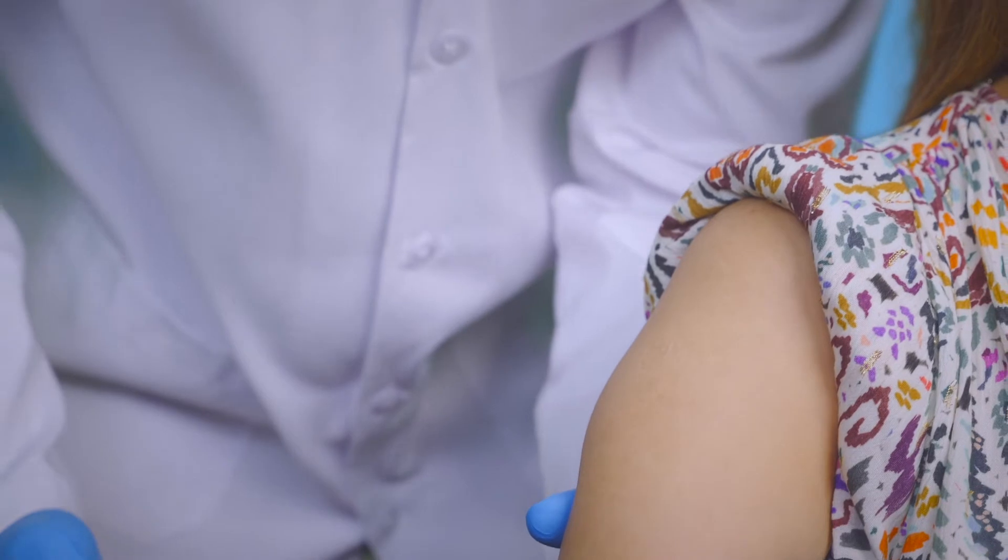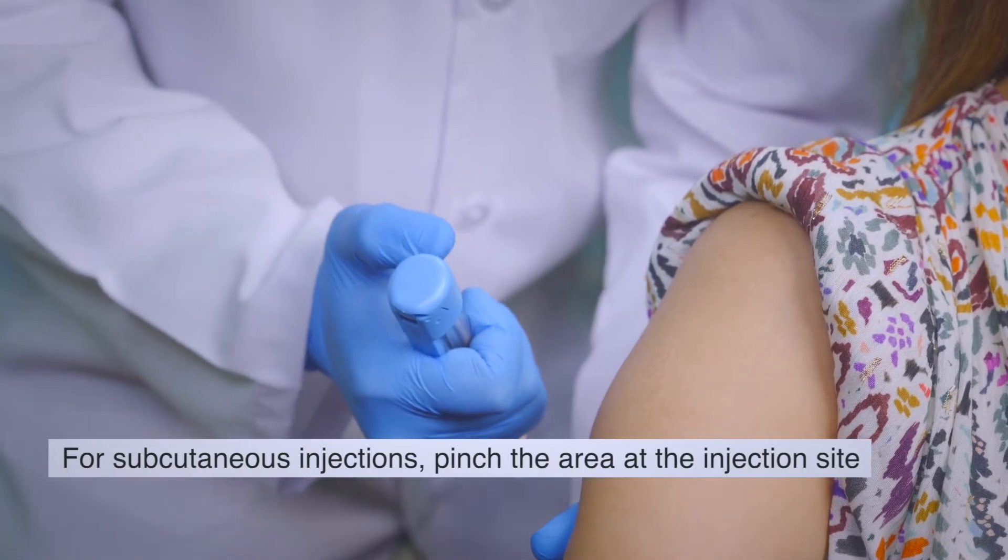Hold the patient's arm firmly from the other side. Open the safety cap on the NFIS device.